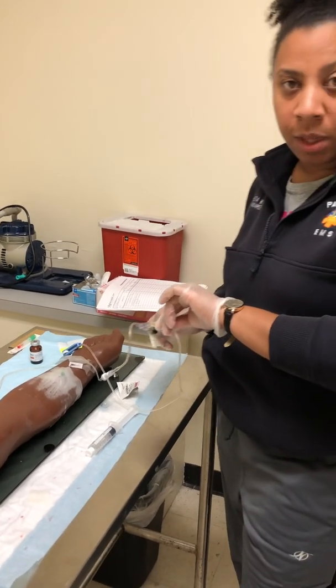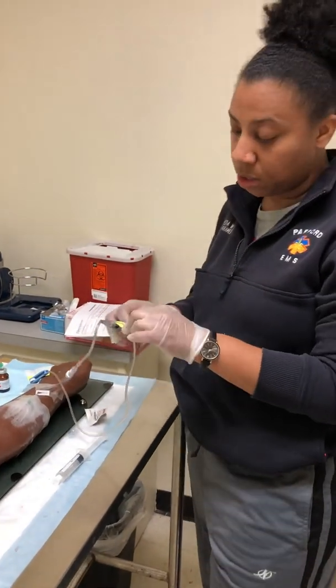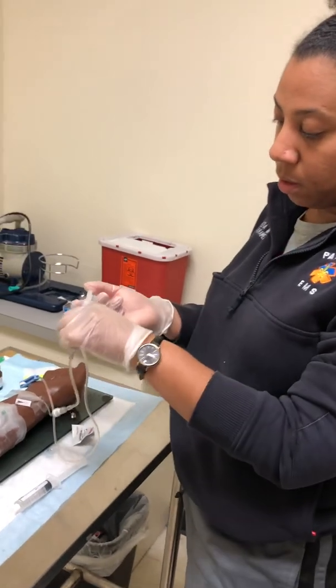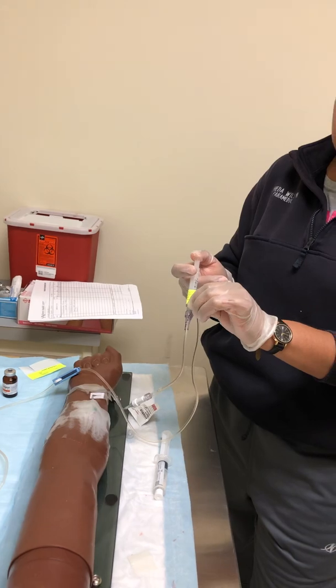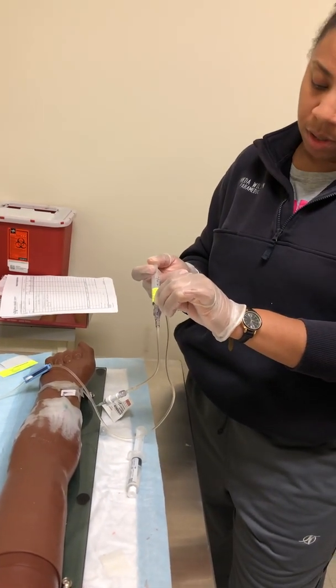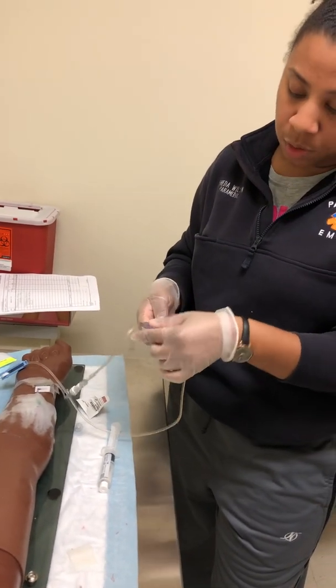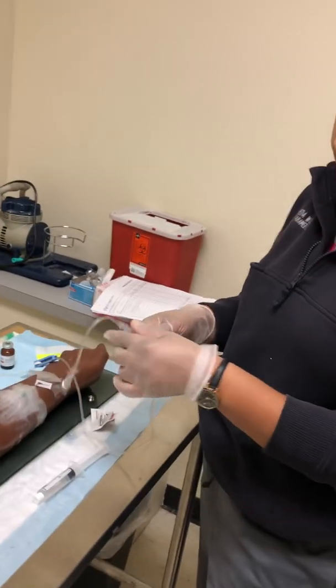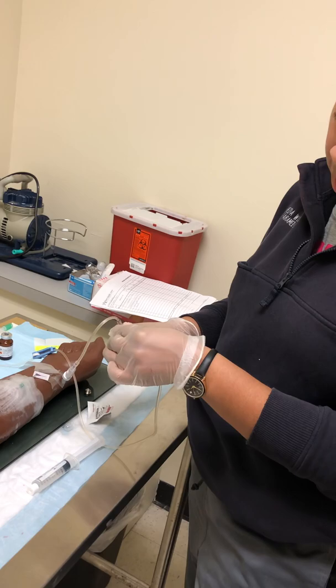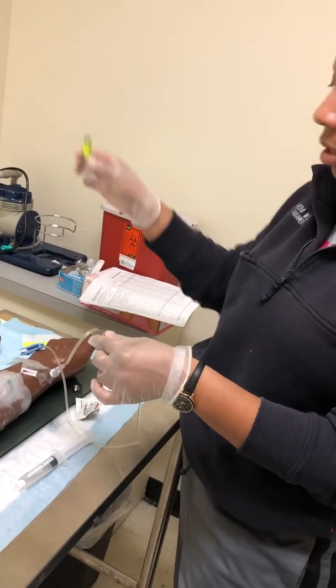Okay, after that 1 minute, I'm going to go ahead and push the other 2 milliliters. Going to clamp it, push over 1 to 2 minutes. My second part of the medication, which was the second 2 milliliters, and I'm going to let it open back up. Once I finish, I would discard this.